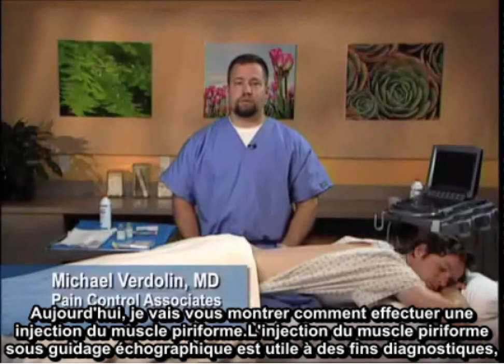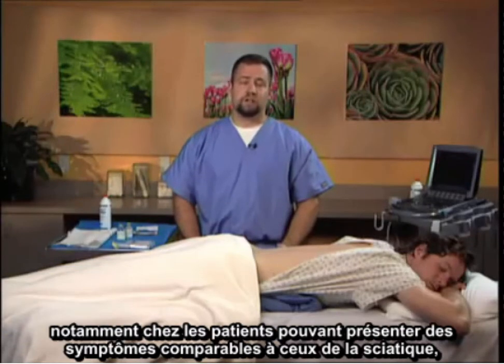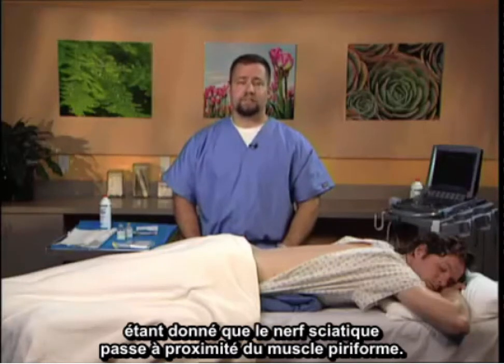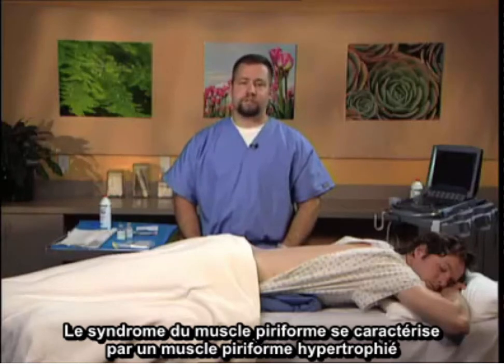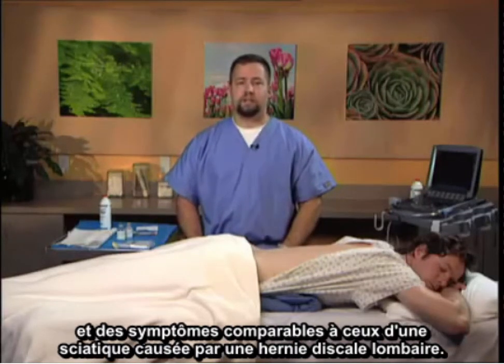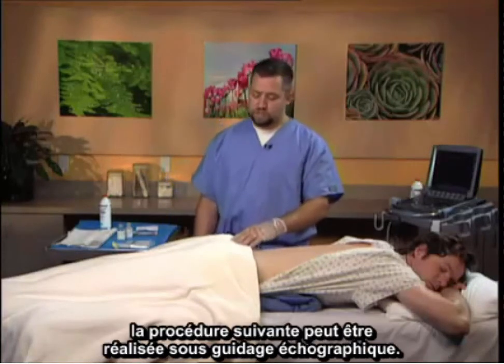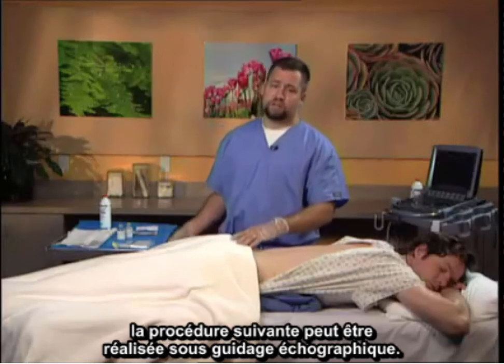Today I'm going to demonstrate the piriformis injection. Piriformis injection under ultrasound guidance is useful in diagnostic maneuvers, specifically for patients that may have sciatic-like symptoms as the sciatic nerve passes close to the piriformis muscle. In piriformis syndrome, the piriformis muscle is hypertrophied and can mimic sciatic symptoms caused by lumbar herniated discs. If this has been excluded, this particular procedure can be done under ultrasonographic guidance.